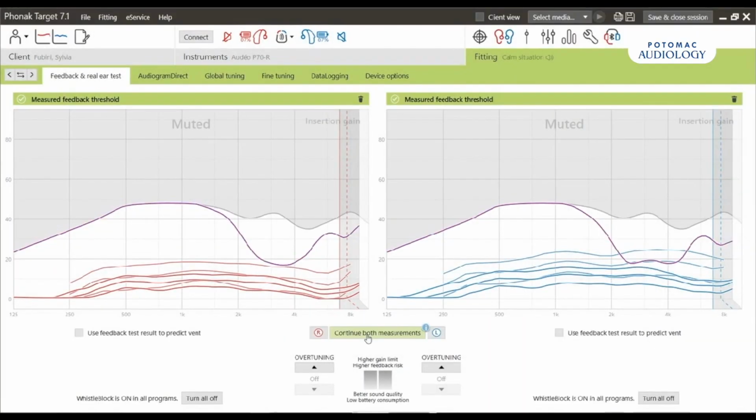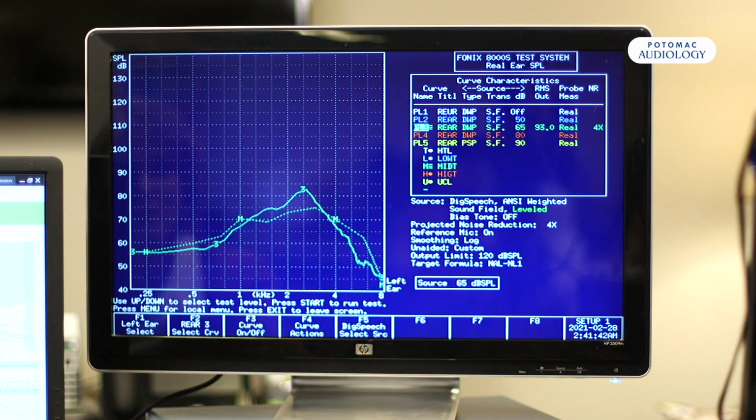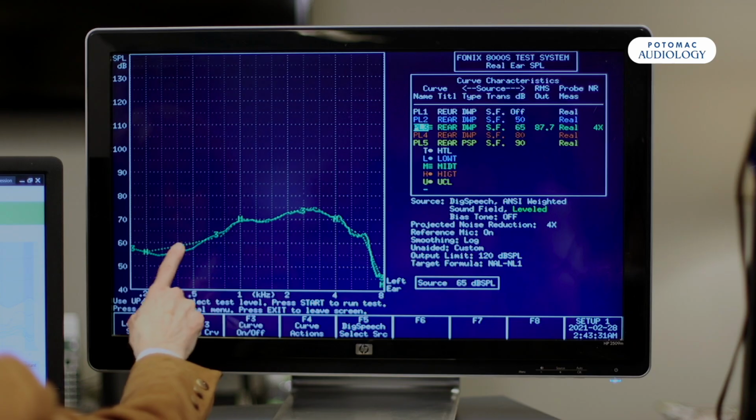that target. So hearing aids are like little baby computers, if you will. They have bands on them like keys on a piano, and we can make those bands louder and softer to frequency shape them. When we're matching the target, we simply make each band loud enough to match that prescriptive target. So therefore, all across the frequencies, the hearing aid is delivering the sound that the patient needs so that their hearing is as close to normal as possible.